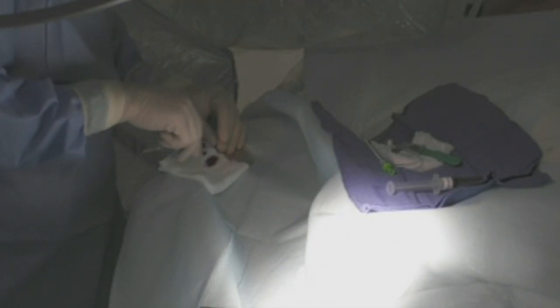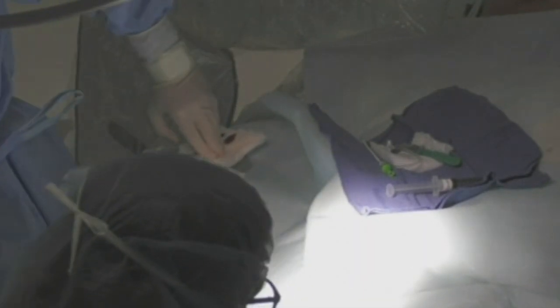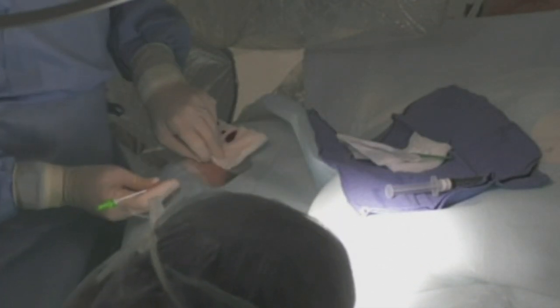Here we have a case of a woman in her 60s who presented to our hospital with predominantly aphasia and a left middle cerebral artery occlusion.